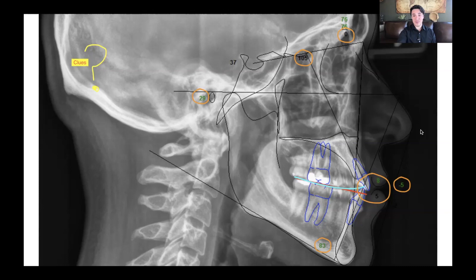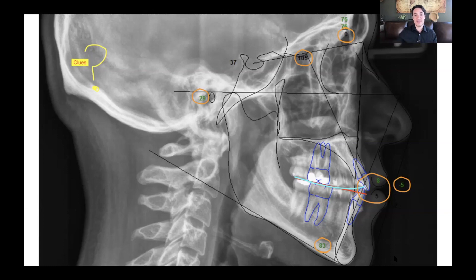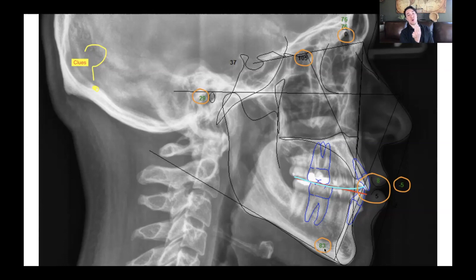Another thing to consider is I'm an adult, so my nose is still growing, unfortunately. For younger patients with little button noses and plus numbers, their nose is still going to grow, so that E-line number will keep falling back over time. You don't treat to that moment in time — you treat to what the face will be like in five, ten, or fifteen years. Looking at other numbers: my ANB is zero, which means I'm class three. This number here is how flared my upper teeth are — about 105 degrees, which is good. My lower teeth are more upright at about 83 degrees, where average is 90 degrees. So I can tell I have both a dental and skeletal class three.